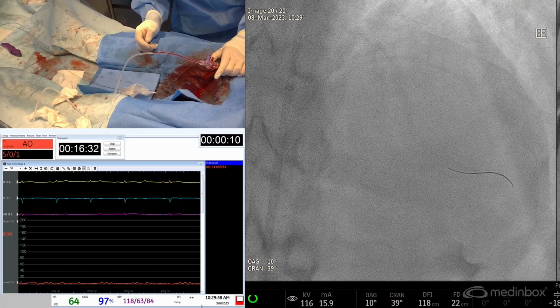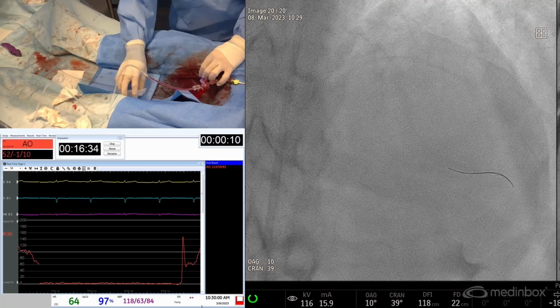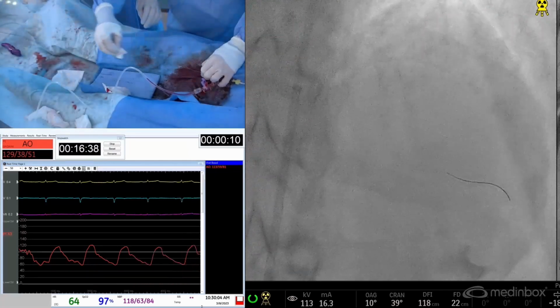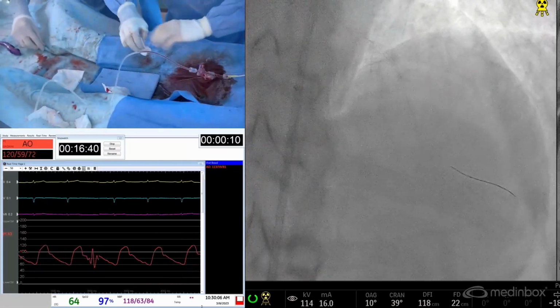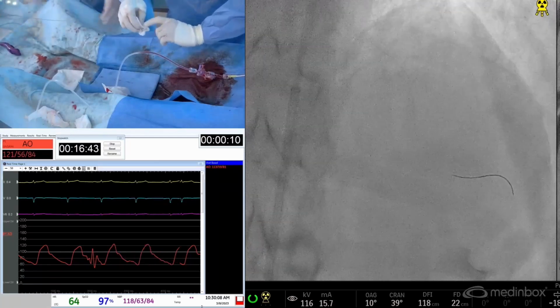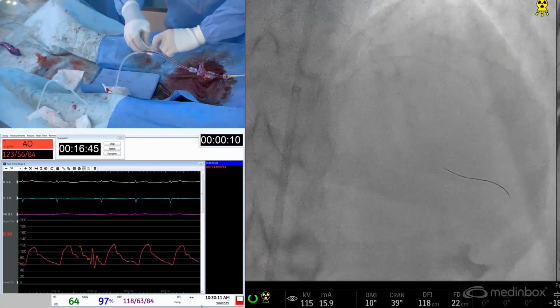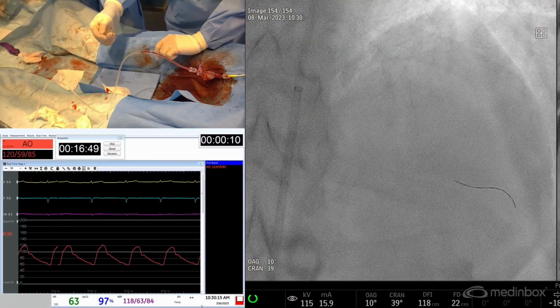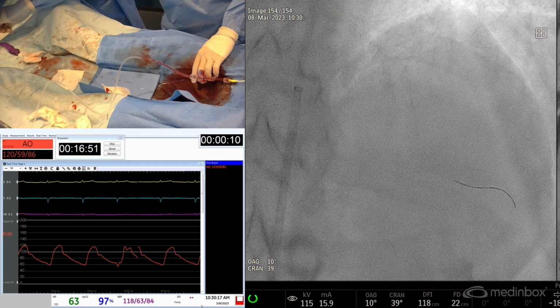They are two different beasts for those who have already tackled them and used them. Even though there's differential cutting and ablation, the mechanisms are not the same ultimately.